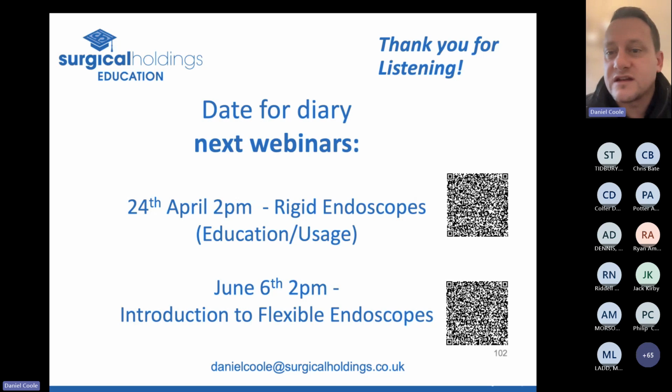We don't check the protein level, but again, this is something we can do. We've previously used a Pro Reveal and tried this, but there might be some other in situ tests that could also be used.